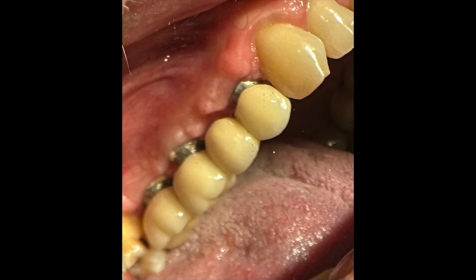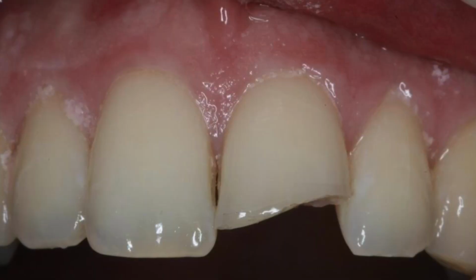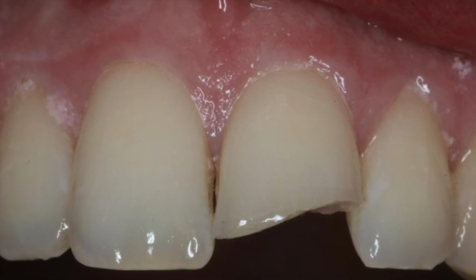I'm in private practice based in Germany, and if you are restoring dental implants and if you have seen crowns coming off, porcelain fracture much more than with natural teeth, and abutment screw loosening.